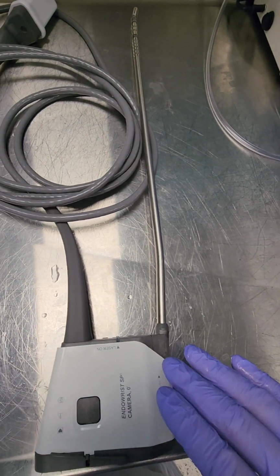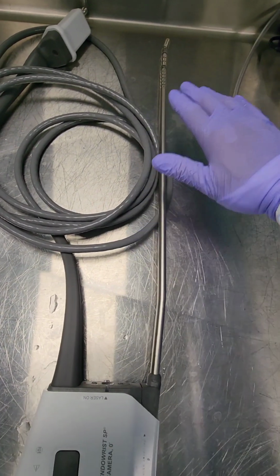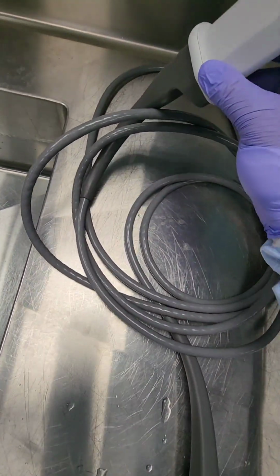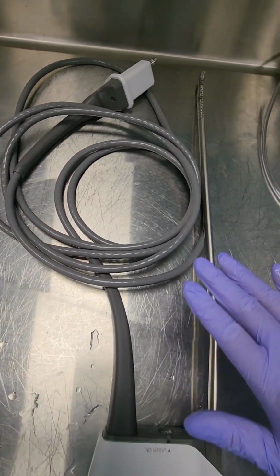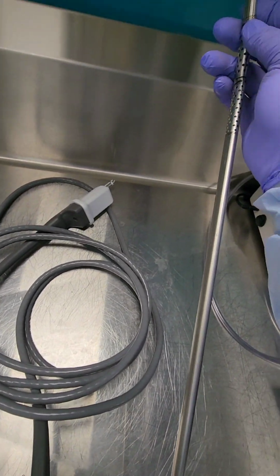You're going to flush your ports, and then you're going to go ahead and submerge this. I'm sorry, not flush, prime. You're going to prime your ports. Flushing is when you're getting rid of fluids. Priming is you're filling the chamber up with fluids so that there's no air trap and there's continuous contact with the internal lumens of the device.